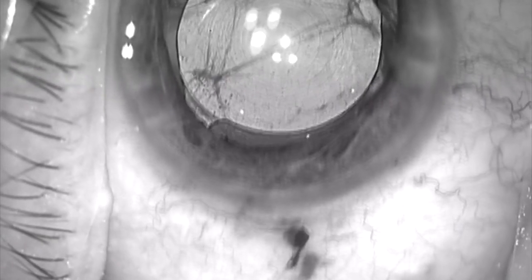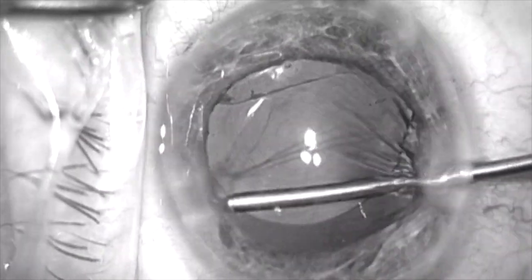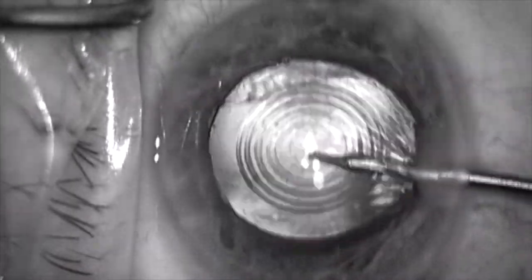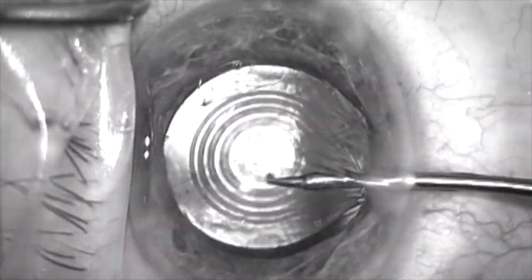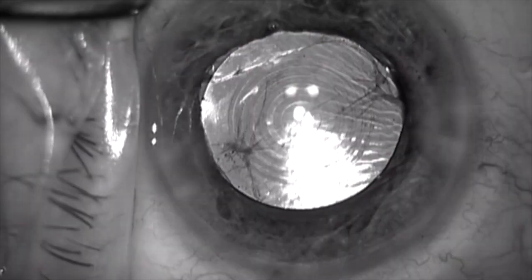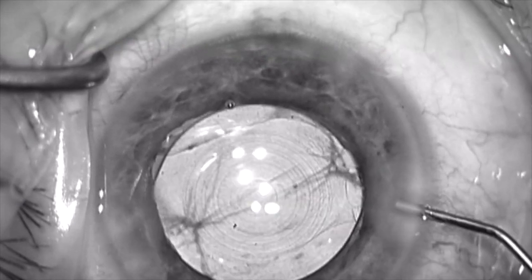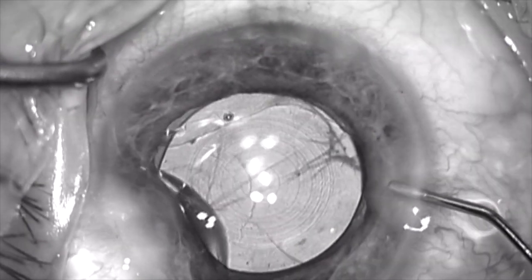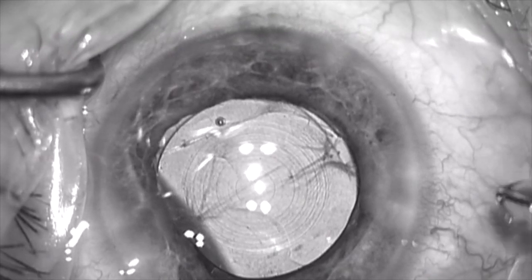At this point I'm going to re-seat the haptic, because after I removed viscoelastic I felt it moved a little bit. Here I'm re-seating the haptic under the anterior capsule where I feel it's very secure. And now instead of removing the viscoelastic with I&A, I'm going to burp the viscoelastic that's remaining out of the anterior chamber. This will push the lens back into the capsular bag rather than shallowing the chamber, which could cause it to come out.